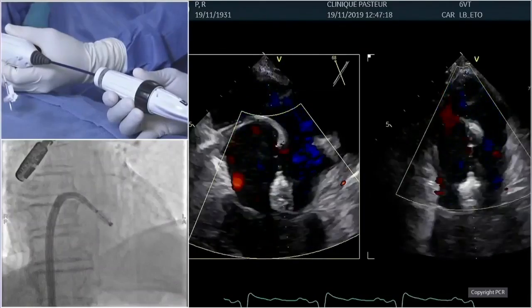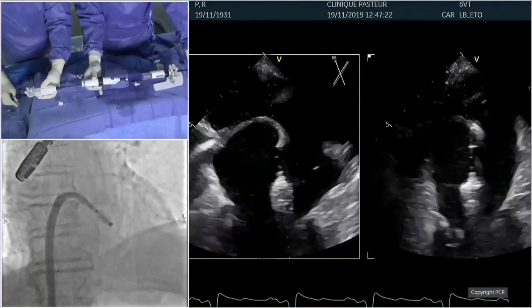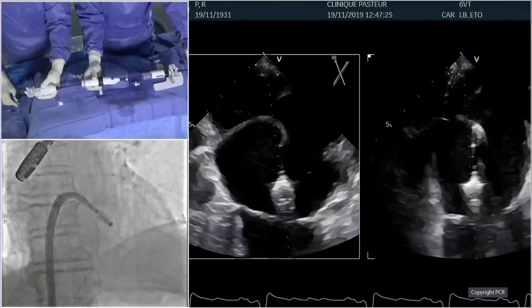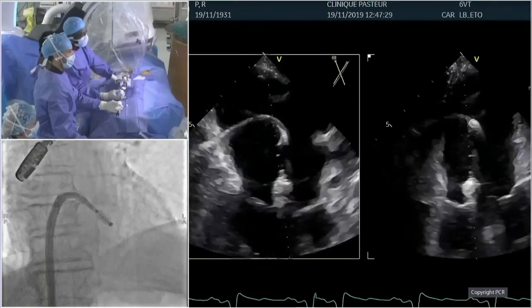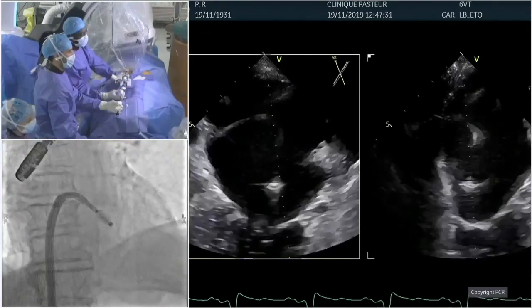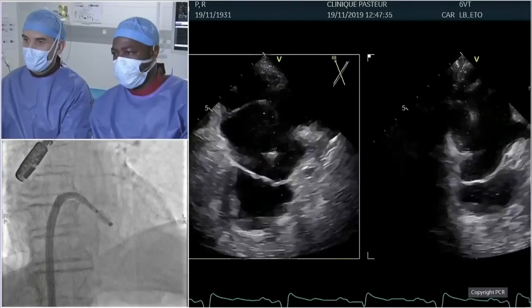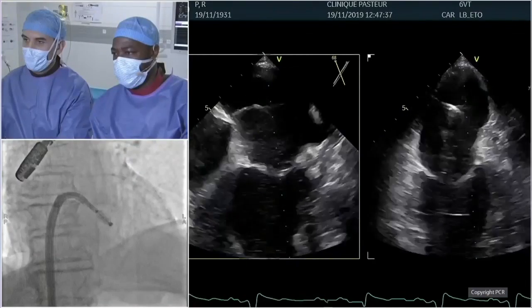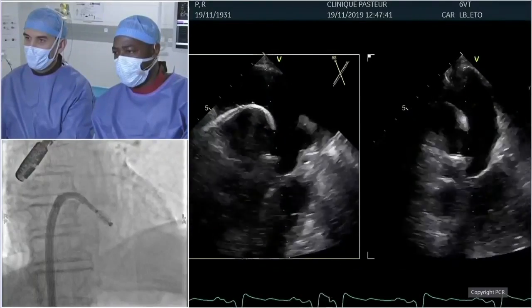Yeah, I mean, the transseptal was just perfect. It was right at the medial commissure, just really lovely. And then the commissural view might need a little more forward rotation because we still see a lot of right heart. And then you see the entire guide, so you may not be able to get the guide out because it's actually quite nicely positioned.